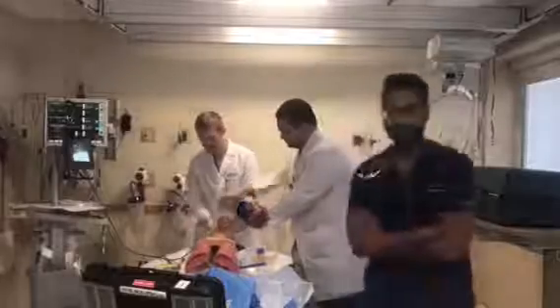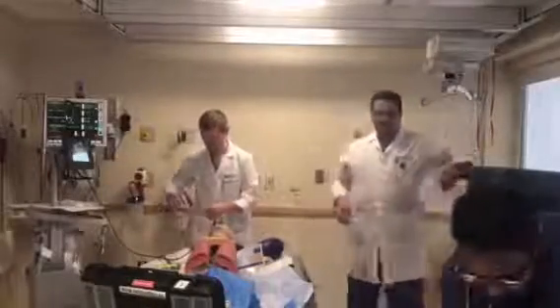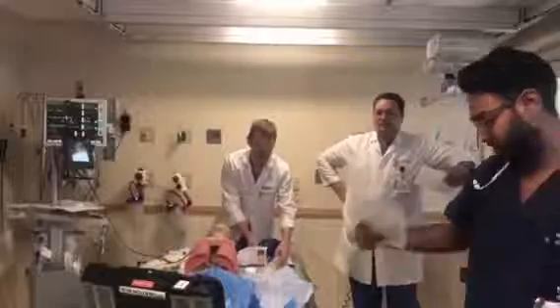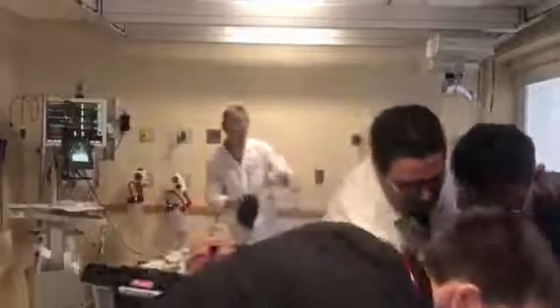Meanwhile, Professor Lavender is getting us the real intubating LMA, the one that we didn't need for this. Oh, I'm getting it? Yeah. Okay, where was it? I'm gonna leave you to drown. Tick tock, tick tock. Patient is dying. 75, bradying down. Is this it? You didn't ask for the atropine. Atropine? Is this it? What do you need? Fourth row. Oh, fourth row.